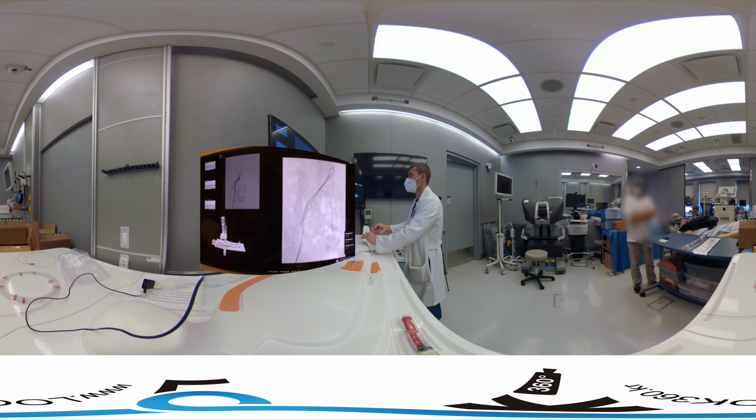Yep, and we're in the uterine branch. You can see there that it's supplying the uterus. We want to get farther out. So what I'm going to do is pull down everything to try to give us a little bit more stability with our 5 French base catheter. You can see everything's kind of sliding down a little bit. We're going to stop there.